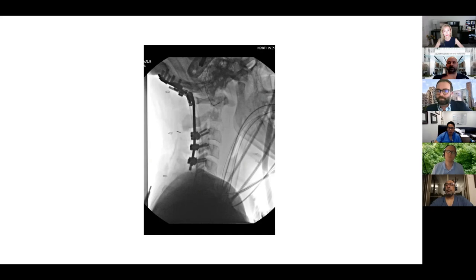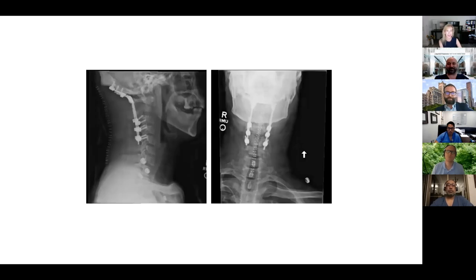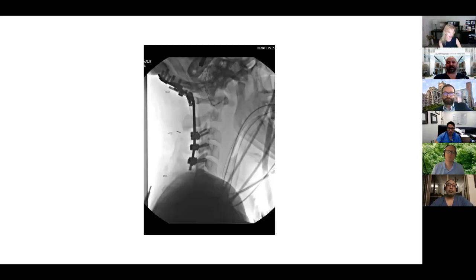That's fantastic. I apologize for interrupting yet again, but I want people to pay attention to something. You have so many amazing pearls in these pictures. If you go back to that fluoroscopy, I want the fluoro picture. I just want the folks on the call to look at the mandible, look at the angle of the mandible, and look at the spinal column. Look at that space behind the mandible, that retromandibular space. I'm going to mention something about it in my short presentation at the end, but I just want people to look at that area and I'll get back to it. I'm not going to give away the answer.